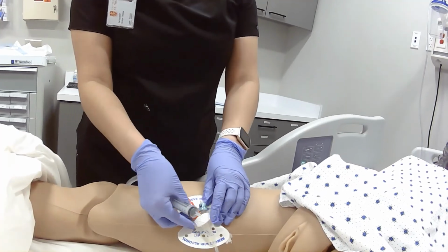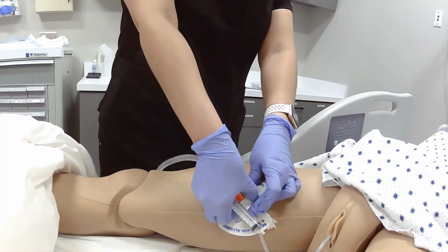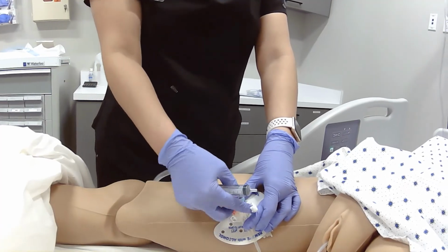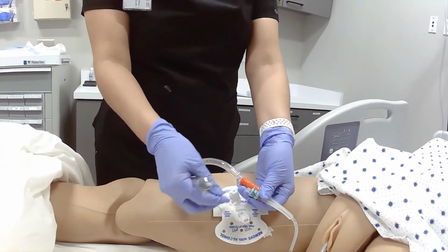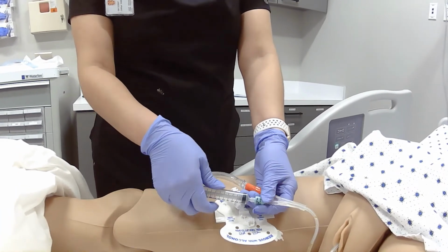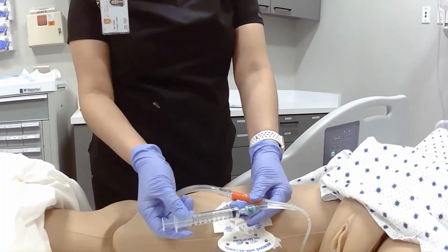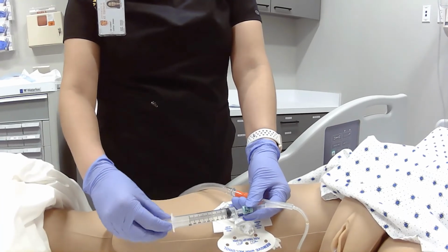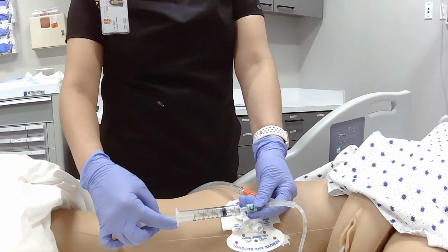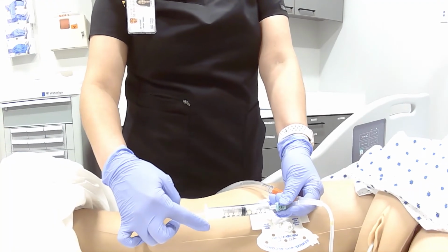And then the next thing that I'm going to do is, I already emptied and assessed the urine. So I'm going to remove this from the stat lock. Get my new 10 cc blunt tip syringe to go into the port. And right away you'll start to see that syringe fill up with the sterile water. But I'm going to gently pull on the plunger to expedite that water filling back up into the syringe.